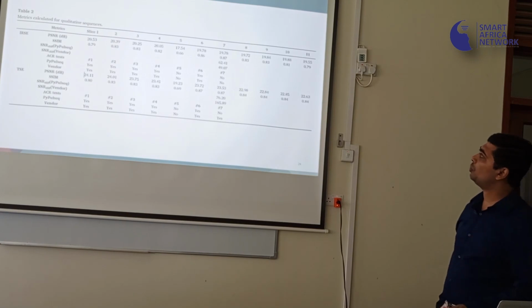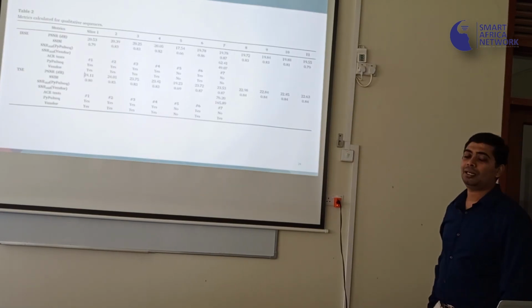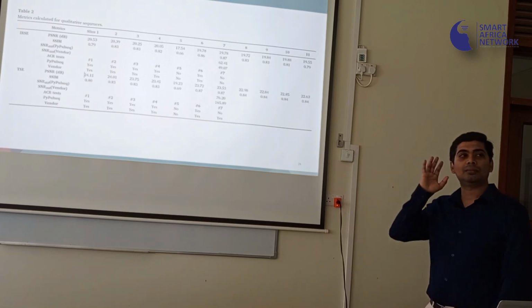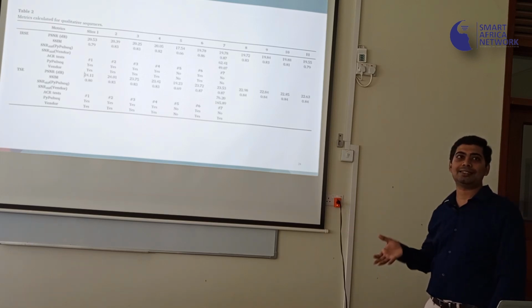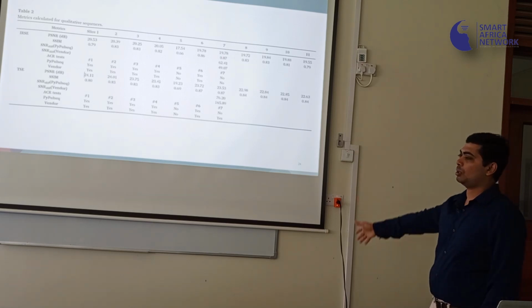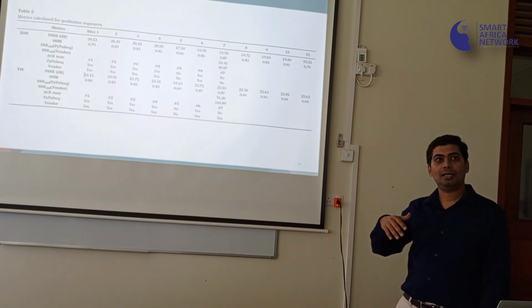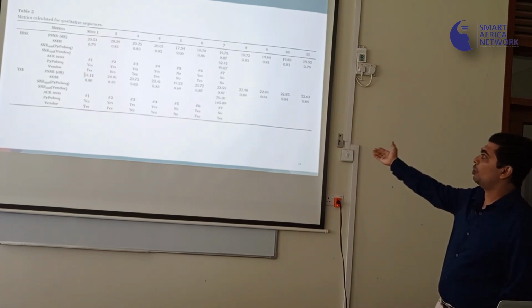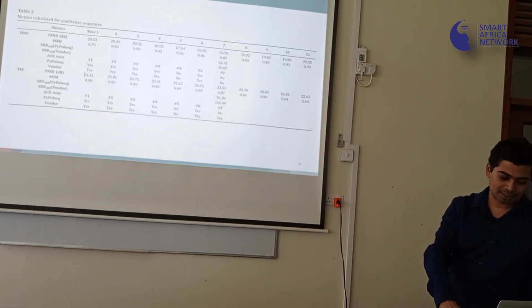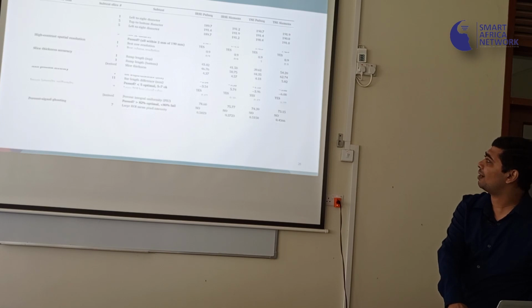There are a bunch of tools, tests as well. So I'm from North America, so the American College of Radiology is the standard there. They have a bunch of tests to say whether a particular sequence works or not. So we've actually benchmarked those tests, and you can see that we're doing okay there as well. This is a continuation of the same ACR tests.